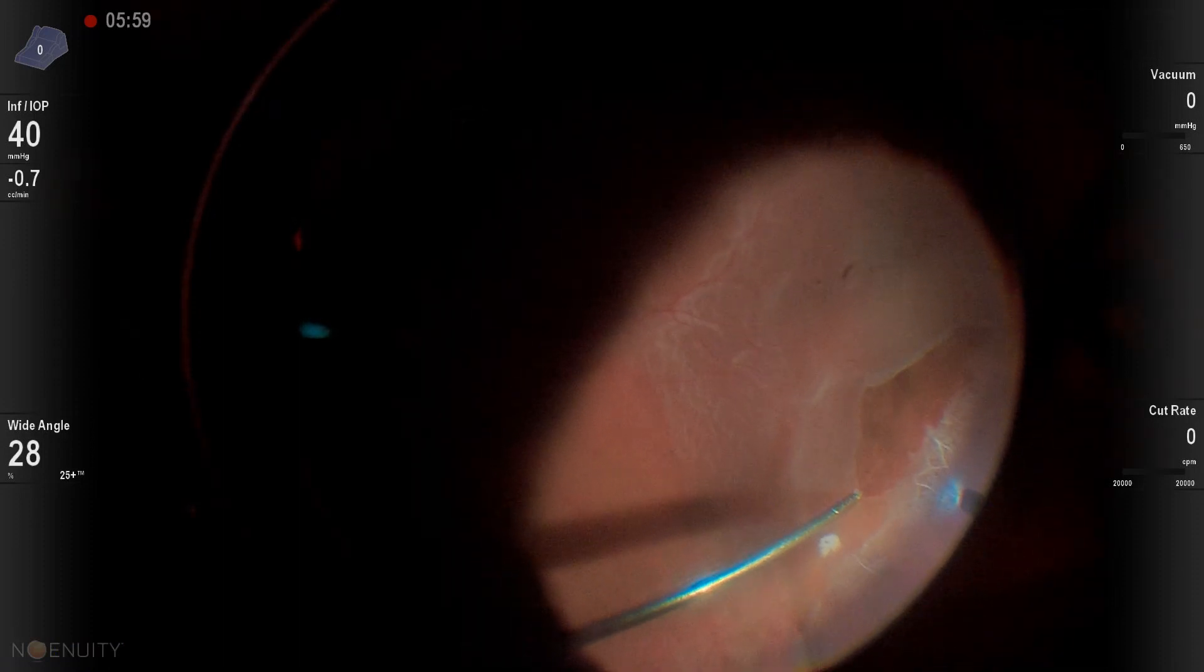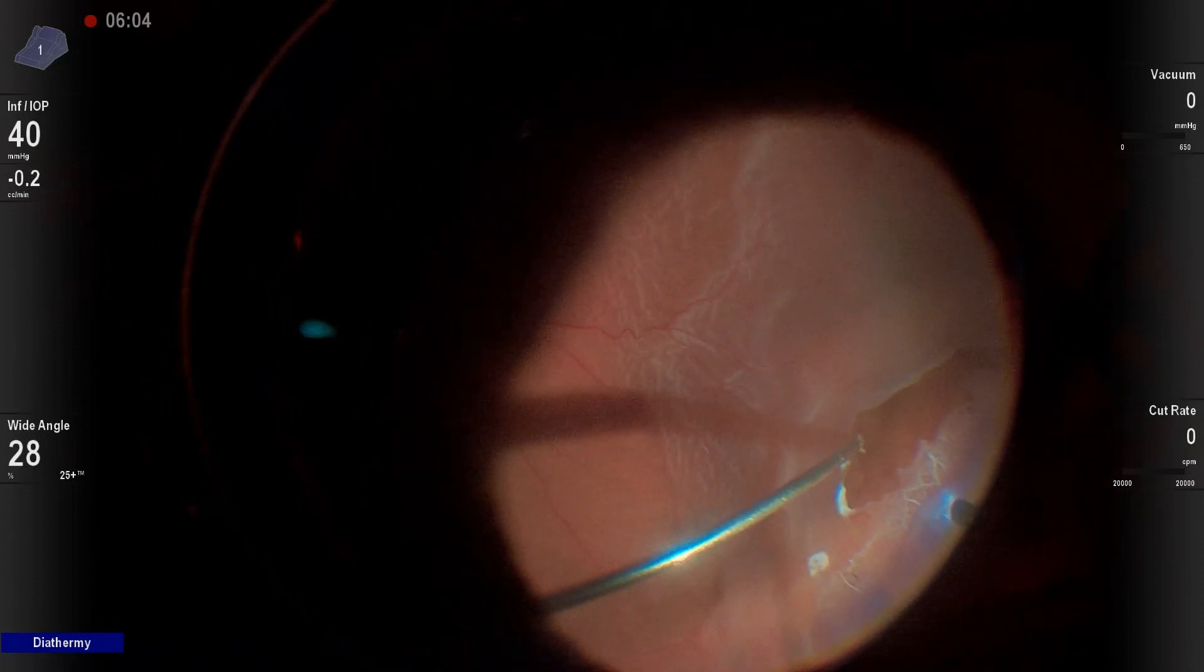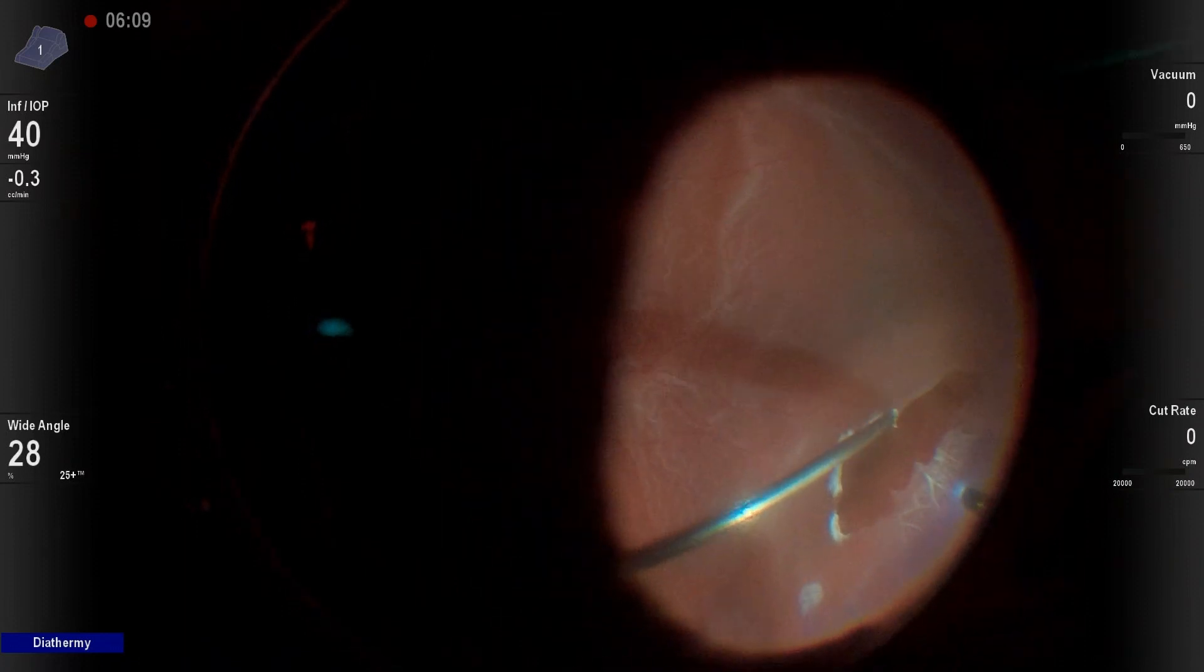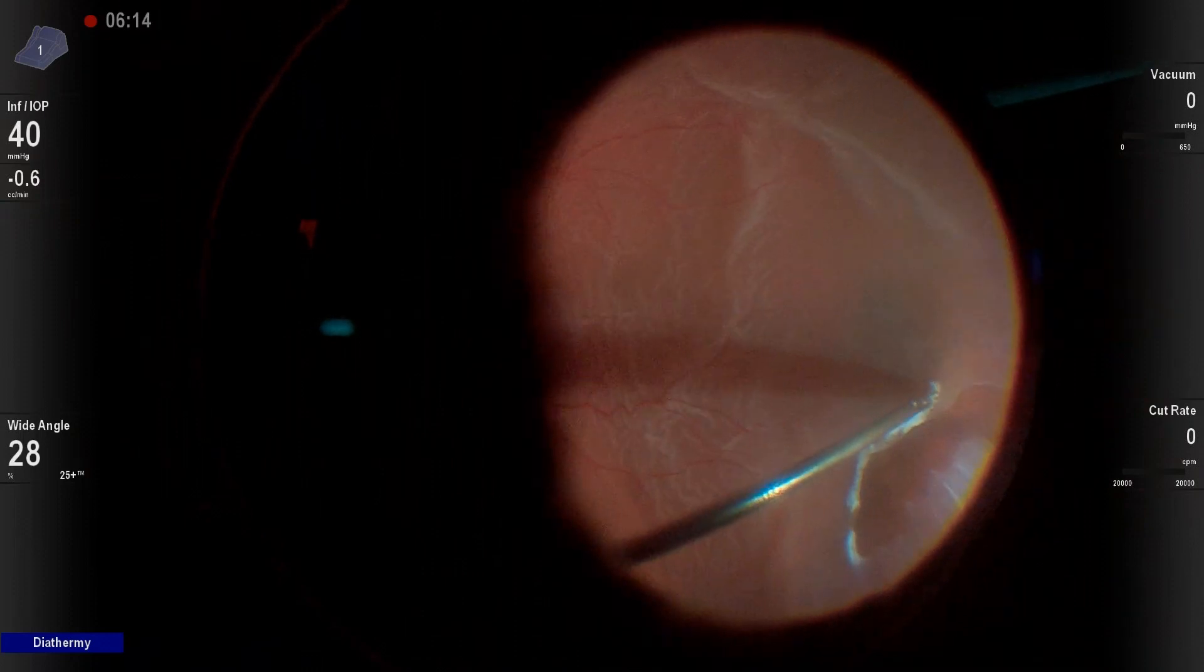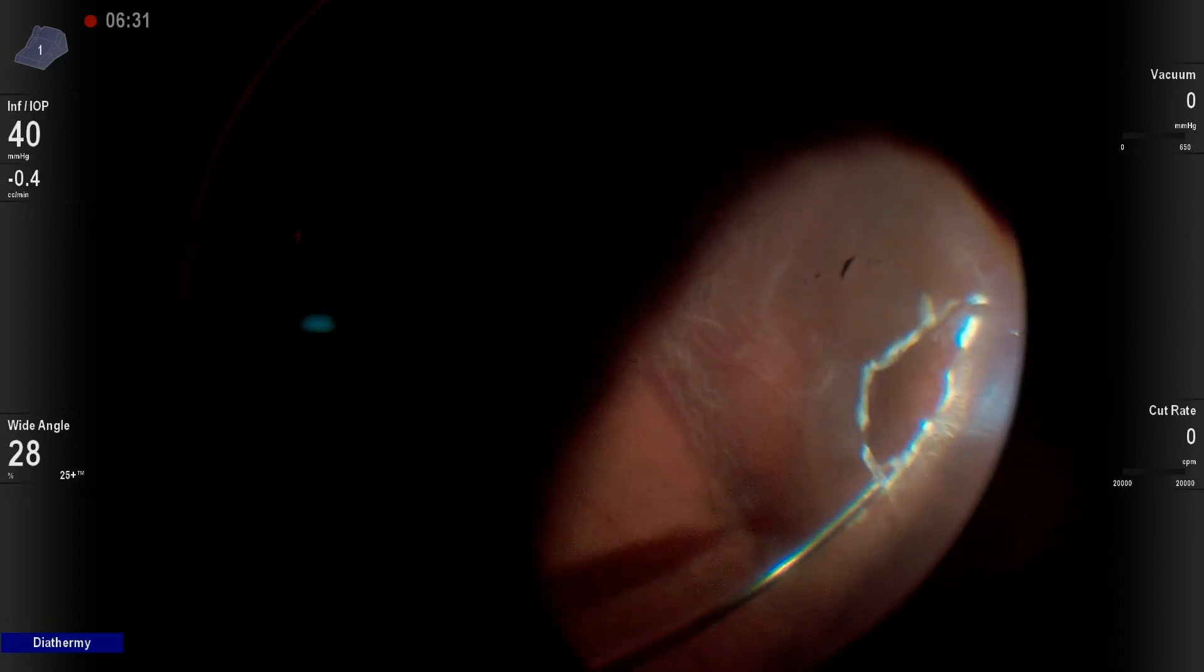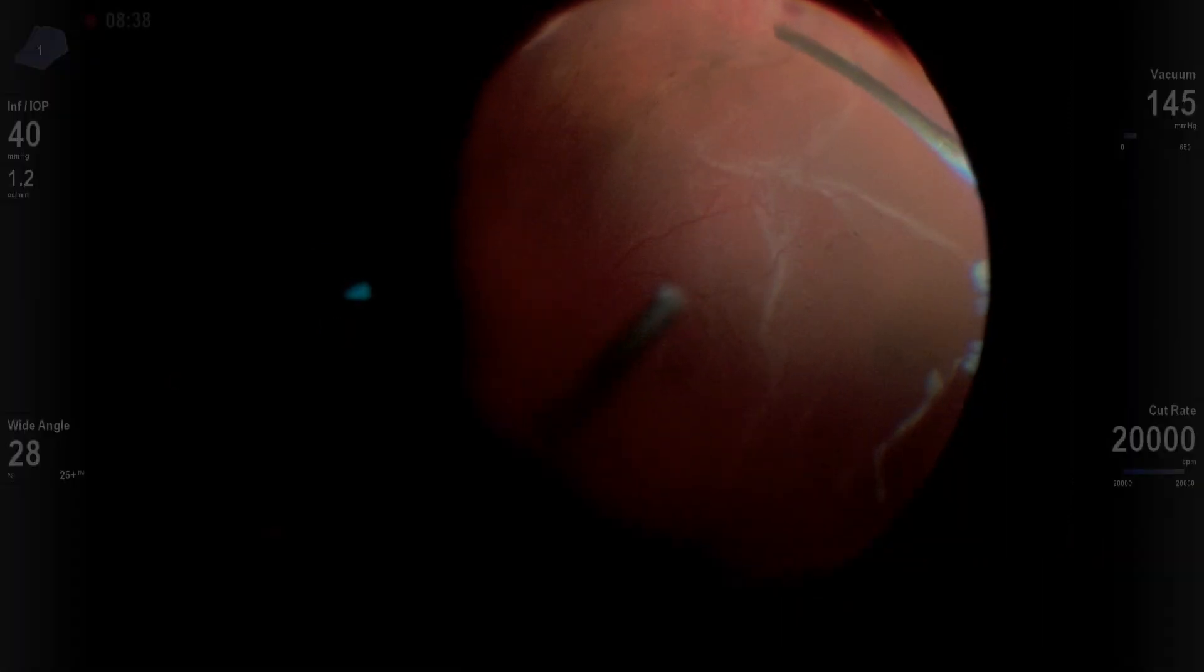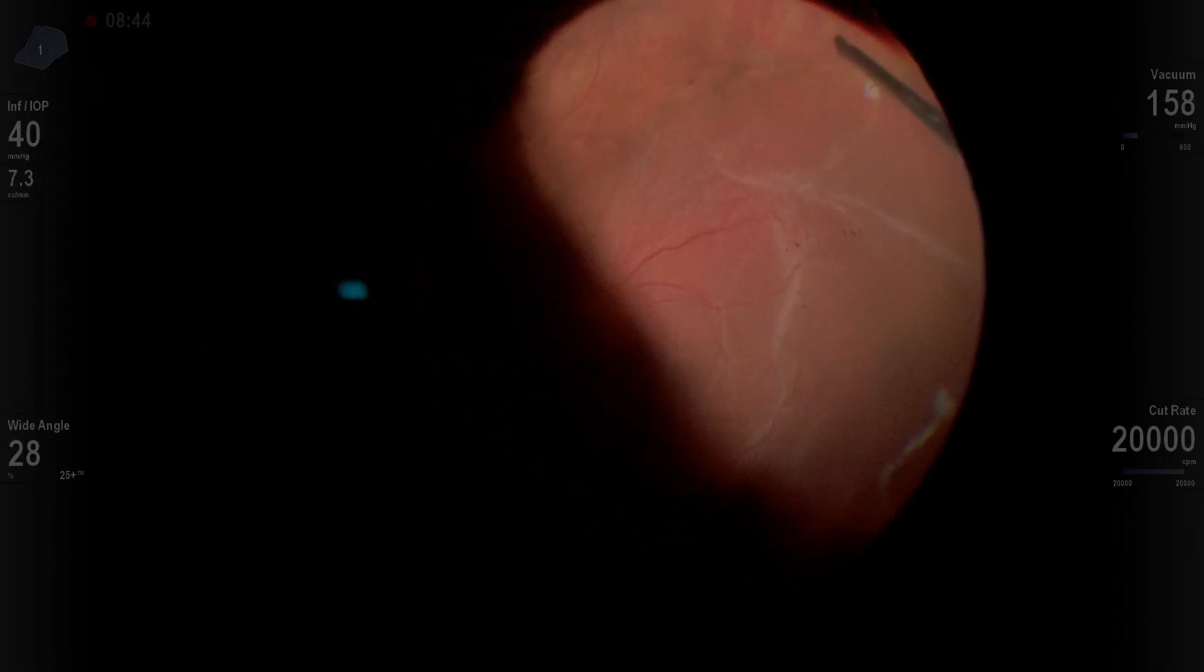We're going to shave over our break. I like to diathermy. This patient had several breaks in addition to this fairly large break that you can see we're diathermizing now. Diathermy both the anterior and posterior edges. It helps control any kind of bleeding from bridging vessels or vessels that may have been avulsed during the tear. And it also helps to identify where your breaks are. So we'll go around and diathermy even this little infratemporal break. We want to identify it so that we can be sure that we have everything lasered up.